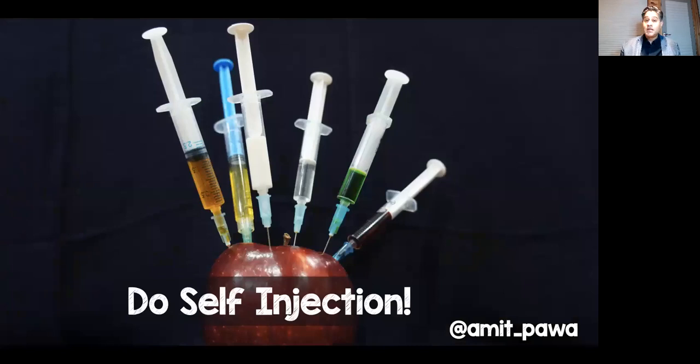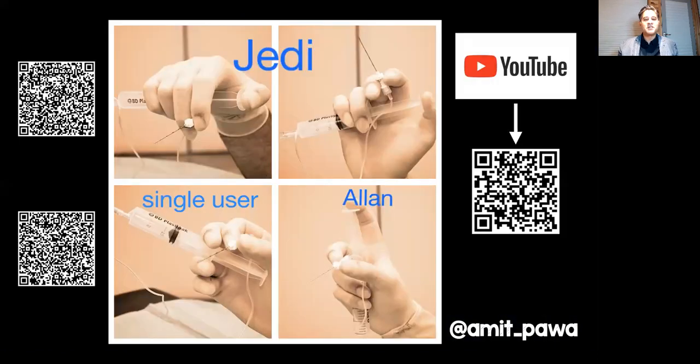The other thing you could consider, and I do this, is self-injection. Now, clearly, I don't mean inject yourself, but do the injecting yourself. There are a number of different techniques that have been described here. I use the Jedi, sorry, I don't use the Jedi, I use the Allen technique, which is pictured in the bottom right. The two that have been described are the Jedi and the single user. They've been published, and those QR codes will take you to those papers.